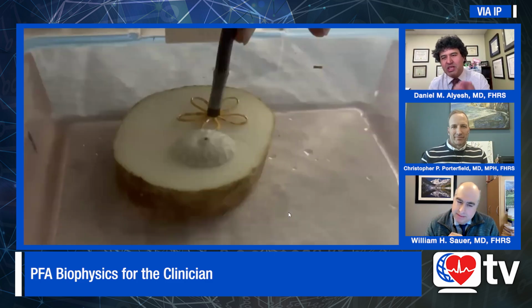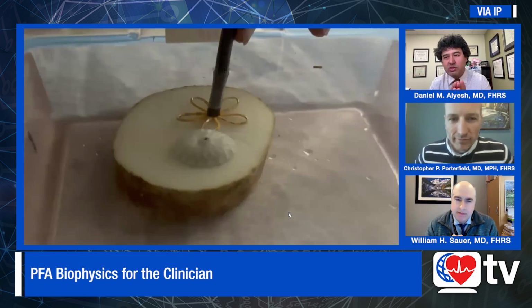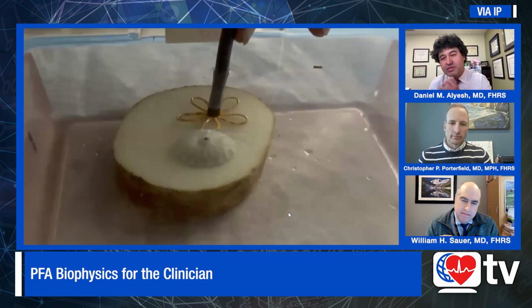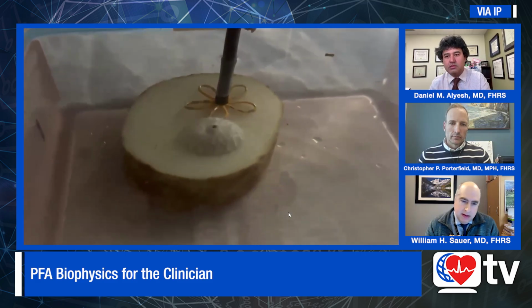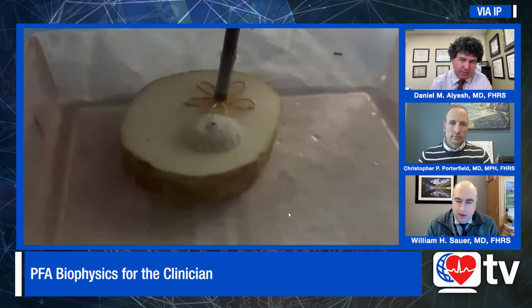So, speaking of which, PFA biophysics: delivering PFA energy with the pentaspline catheter close to a Watchman. This is a very interesting video that you shared with me. I'll play it and have you explain what you're doing here and some of your findings. For our viewers or listeners, this is an experiment we performed where we used a pentaspline catheter, delivered energy, and had an electrode touching one of the metal struts of the Watchman, the left atrial appendage occlusion device.